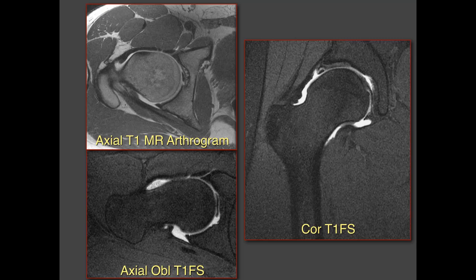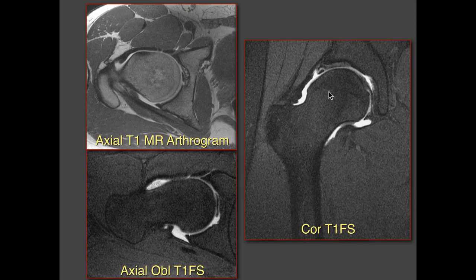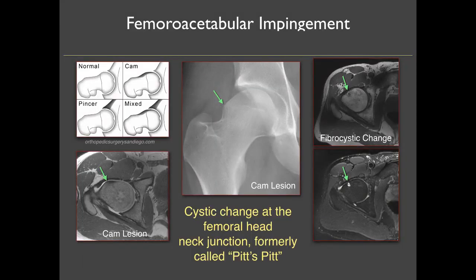We do a lot of MR imaging for FAI, especially MR arthrography — injecting gadolinium into the hip joint. Here's the CAM deformity on the T1 fat-saturated oblique image, and the coronal T1 fat-saturated image showing a tear of the acetabular labrum superiorly along with that CAM deformity. FAI is a very popular diagnosis these days. We've looked at cystic changes along the femoral head-neck junction for many years without knowing what they were, but they're probably related to FAI.